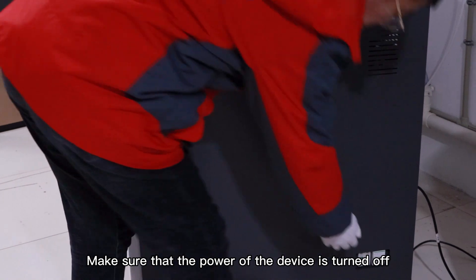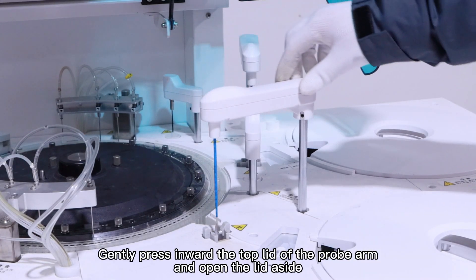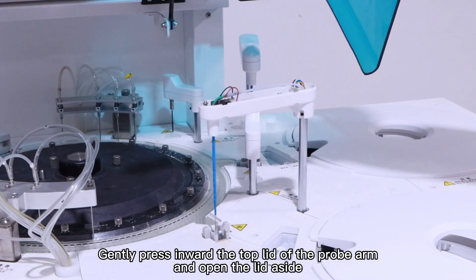Make sure that the power of the device is off. Gently press inward the top lid of the probe arm and open the lid aside.